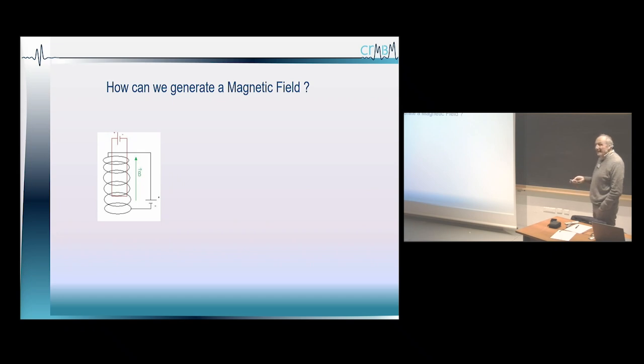But the intensity of the field you can generate with this is not 1.5 Tesla or even 10 Tesla. Because if you are doing this kind of device, you'll be limited by something. Do you know what is limiting the production of the field in this case? Because you are going to heat the wire and you're not able to go further than less than half a Tesla.